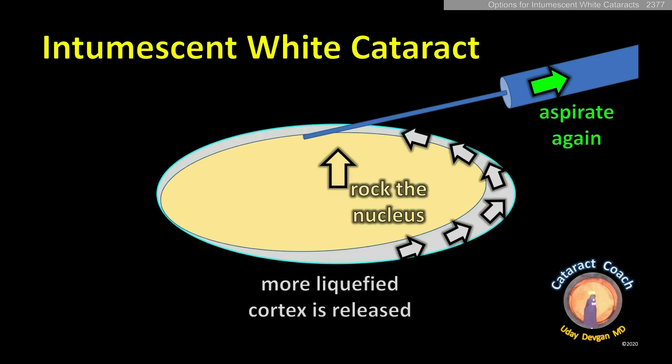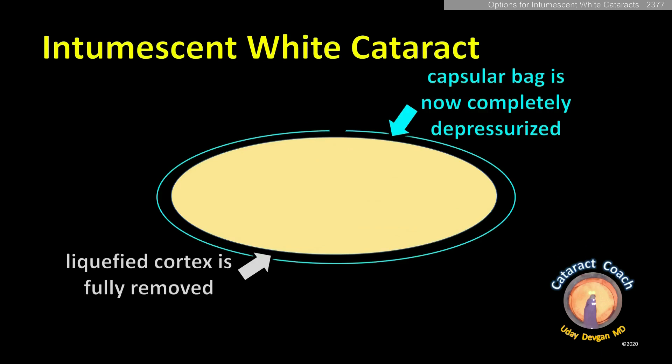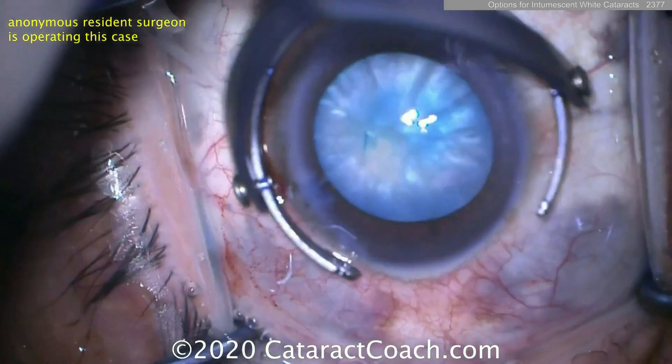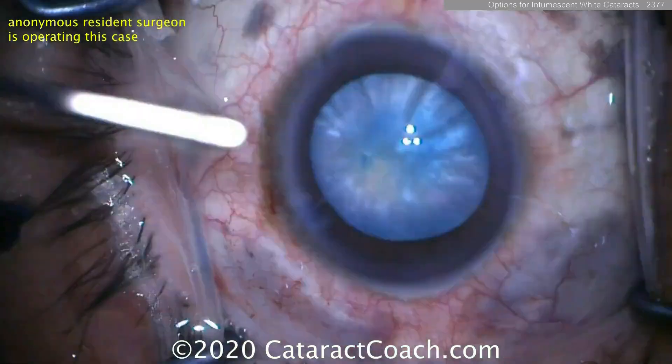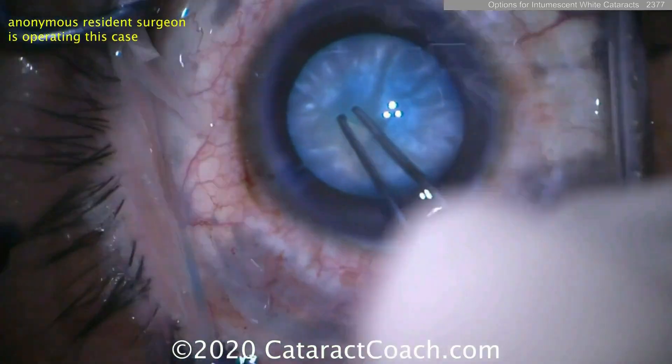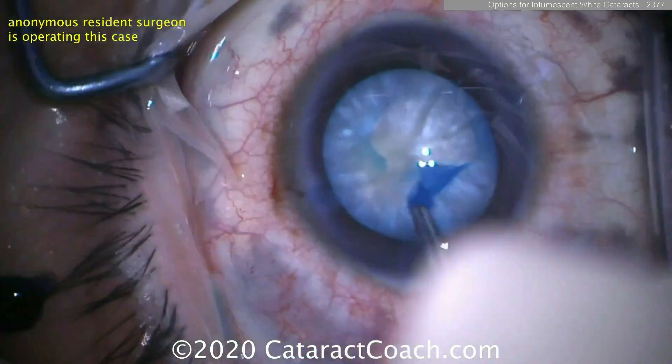Because you still have more liquefied cortex that's trapped. Once you rock it and release that cortex, now you can aspirate it all out — the bag is depressurized and you can continue your rhexis here. Now that the bag has been depressurized and you've gotten out the liquefied lens material, the rhexis is relatively easy to do.